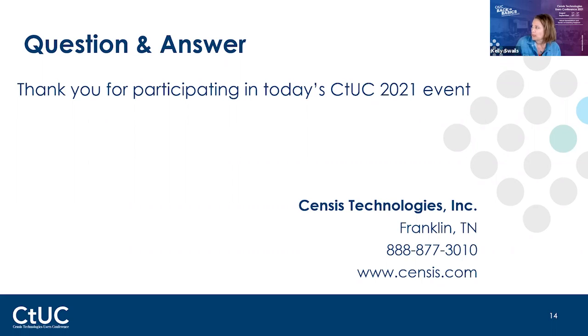I'm looking. And then I guess while we're waiting for his response, one other thing that I forgot to mention is, what do you do with trays that need to be one tray? How would you use the CensiTrac to capture that process? Yep. So with use of one tray, I do see that many sites will now say we no longer IUSS because we have one tray.